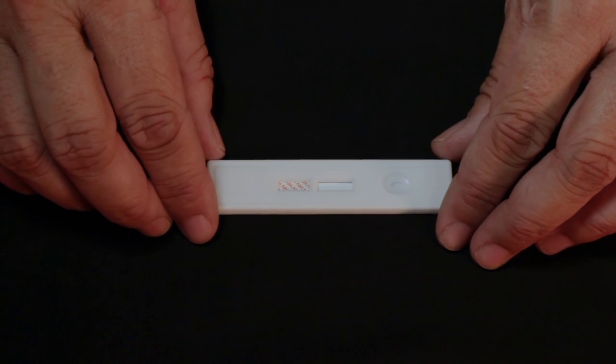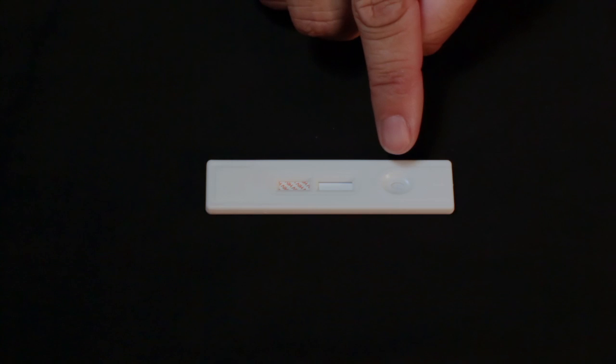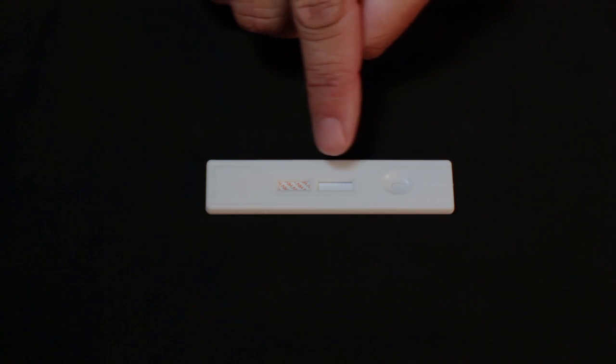Begin by placing the test device on a flat surface. The device consists of two main parts: the well, where you will place the blood sample, and the result window, which will show the results.